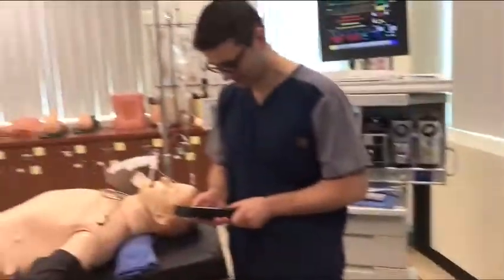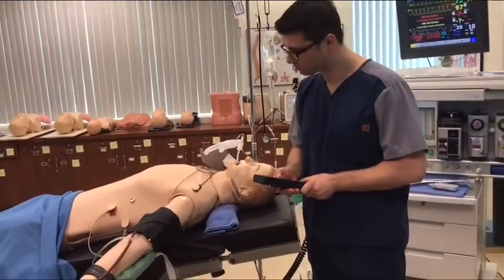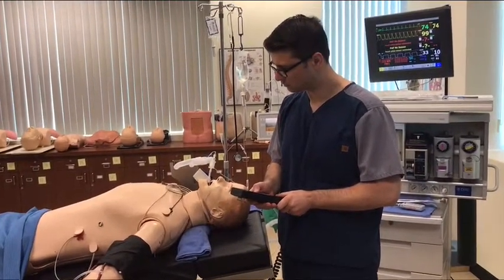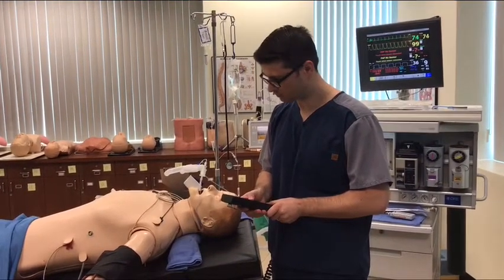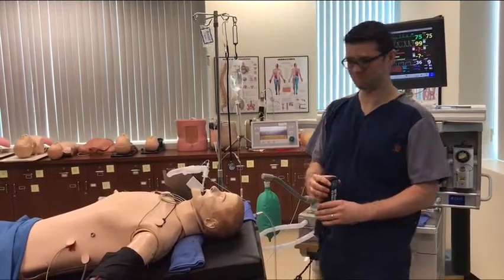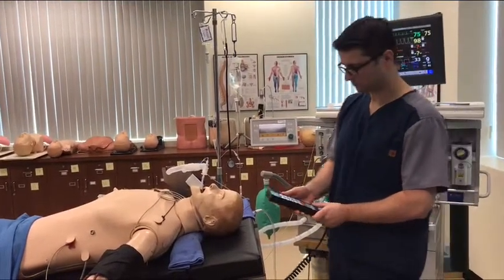Here's a real answer. You just do a little bit, and then if they say, can I have a little more, just give them a little bit more. That's too much. No, I'm just playing. You're good. Okay, so they're establishing the pneumoperitoneum.